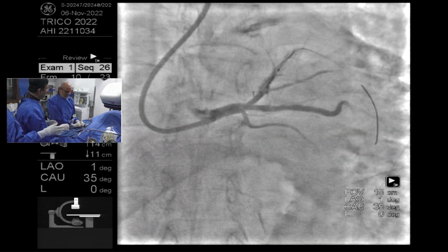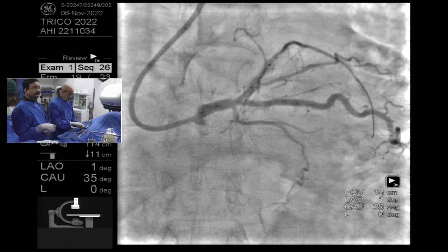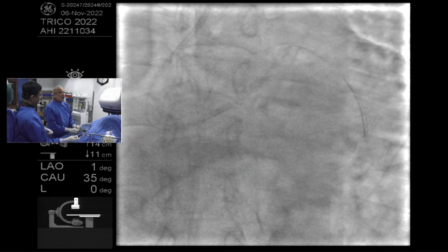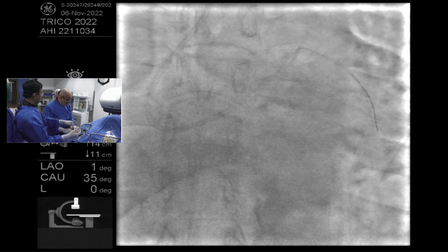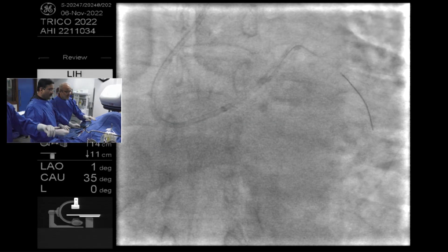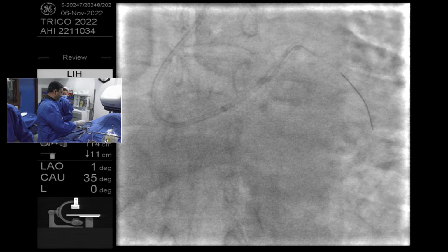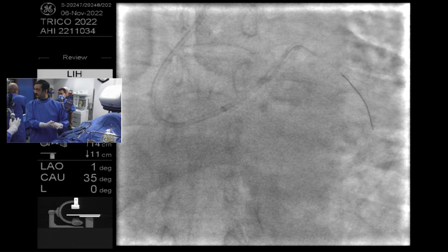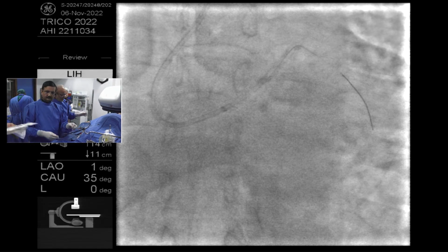And here, from the scenario, it looks like IVL will be necessary. And that is why Dr. Patel is thinking of IVL first. IVL is necessary to achieve a much better minimum stent area. Without IVL, can we use only Rota in this case? Yeah, if you don't have IVL, you can use Rota and stent.